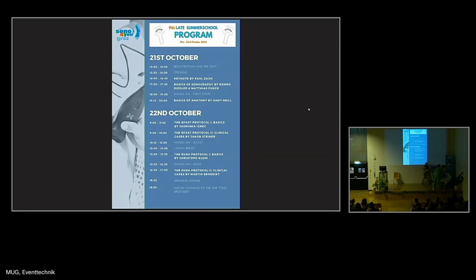Hi, we are bringing you a 24-year-old male. He has suffered a severe fall and now he's totally unresponsive. Thank you very much. Let's start with eFAST.